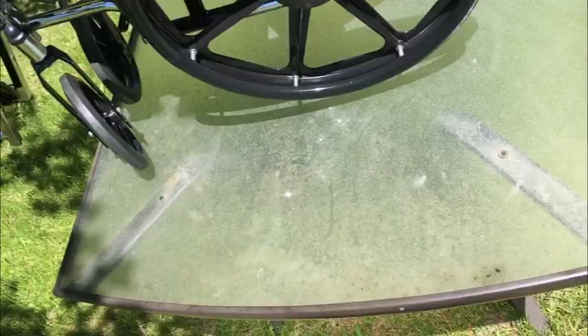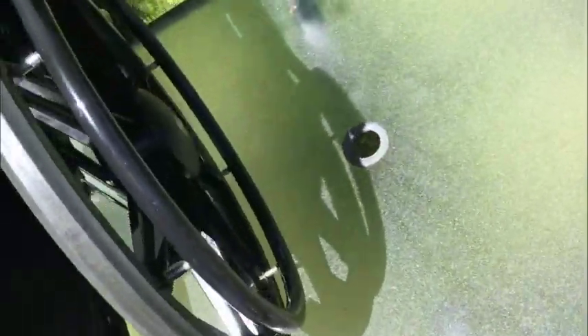Doesn't get any simpler than that. You need a cheap wheelchair that folds, that's the one you want. I'm going to take some photos — they'll be higher quality than this video. Make sure you study them.